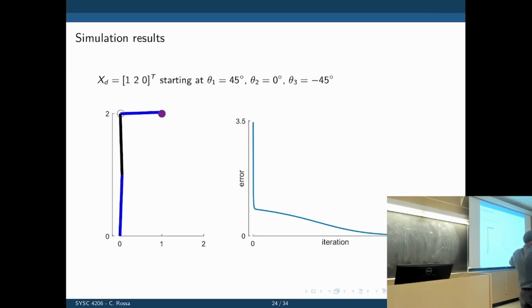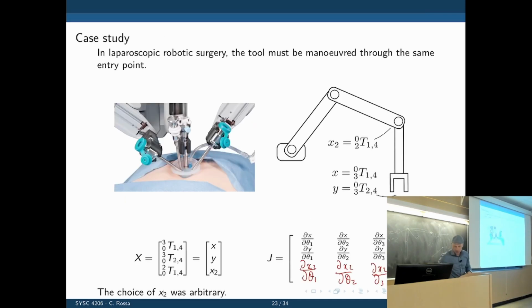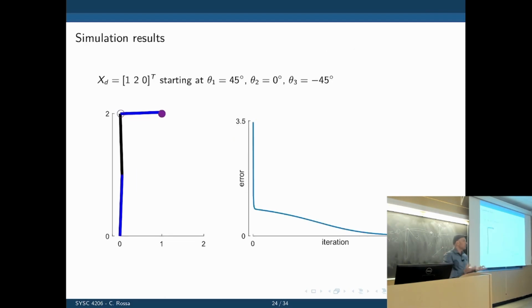You can see the utility of that in laparoscopic surgery here. I would make sure that the robot goes in with a specific orientation. It's basically another, more complicated way to specify the orientation of the robot. And then you see the result. Now you see this is not perfect. This is not perfectly aligned. We have no guarantee that the cost function will reach 0. So that's the compromise when you use this. We are always allowing a small error to exist.